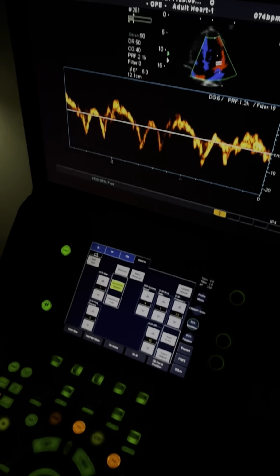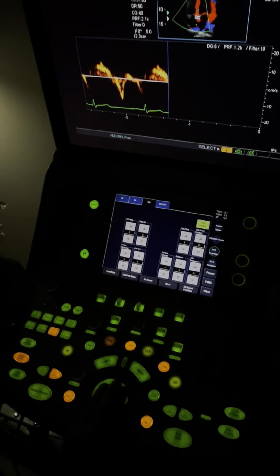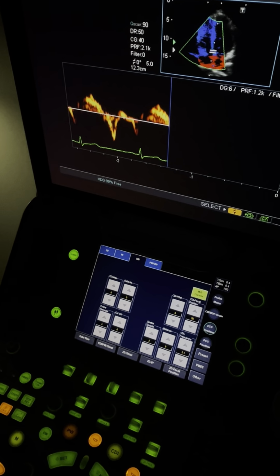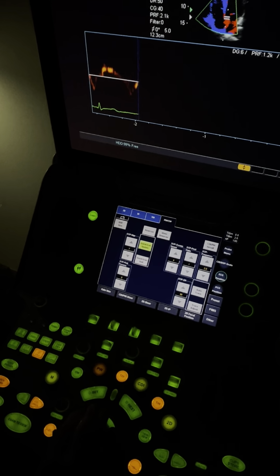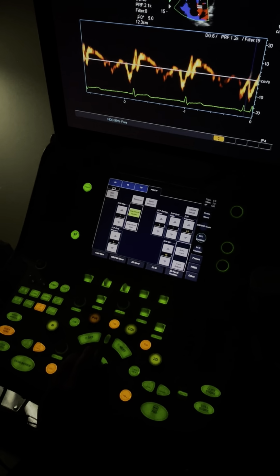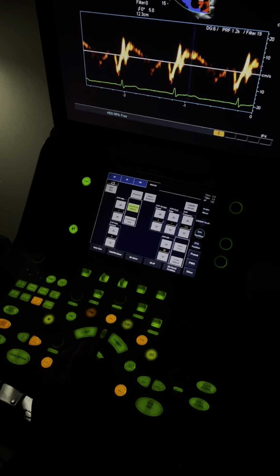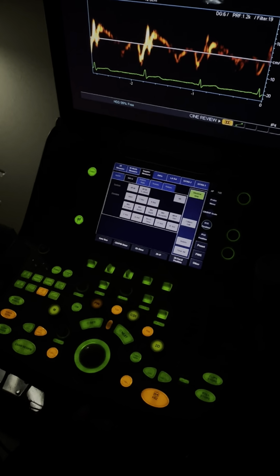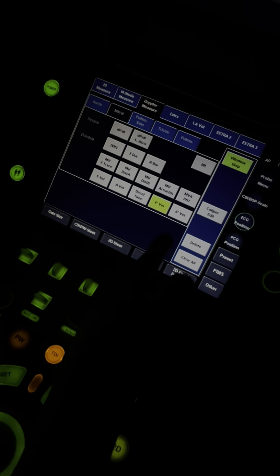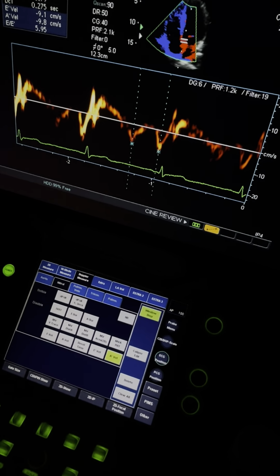Okay. Then keep the same picture. You can update, make sure you're still good. Roll right over here to the septum, or you can go back to your big picture. Update. E prime again. A prime again. I'm using set to lock it in.